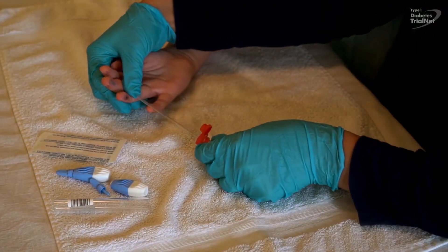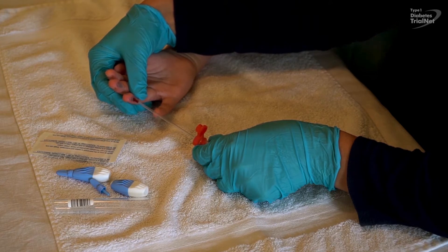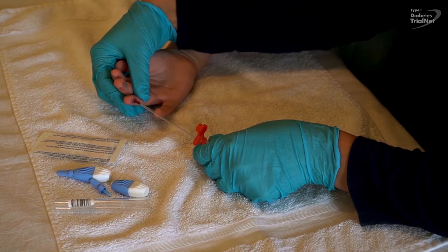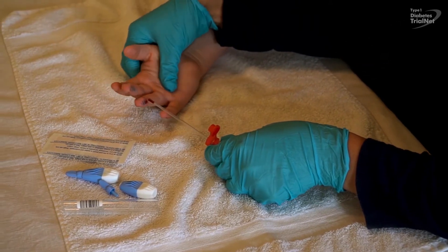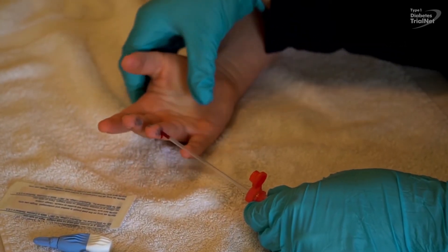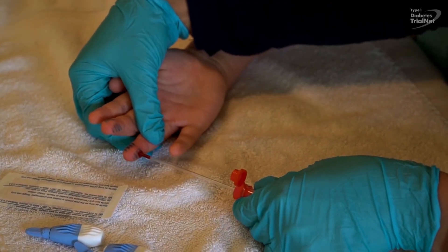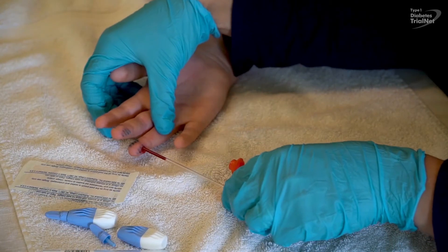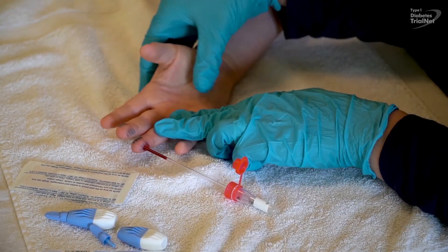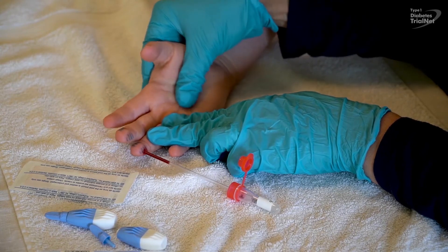To collect the blood sample, hold the collection tube horizontally or slightly inclined and collect with the straw as shown. To maintain a good blood flow, hold the arm downward and massage the hand. But don't press too strongly around the puncture site, as this can contaminate the blood sample. If you need to massage the hand to promote blood flow, you can lay the tube horizontally on a flat surface.